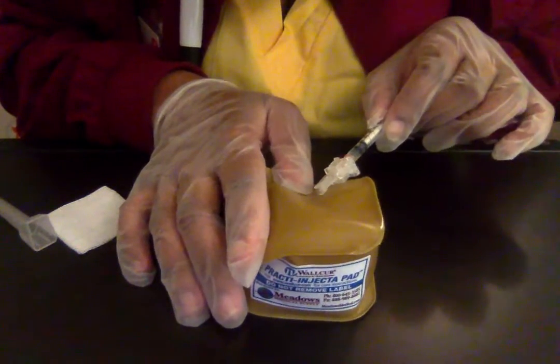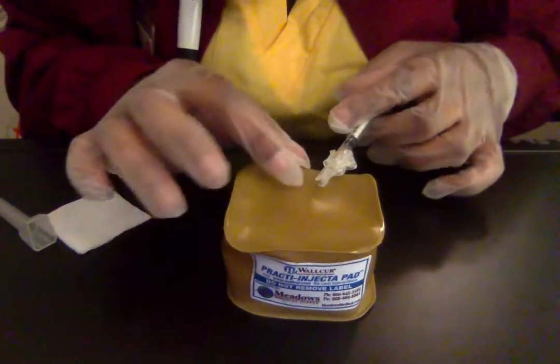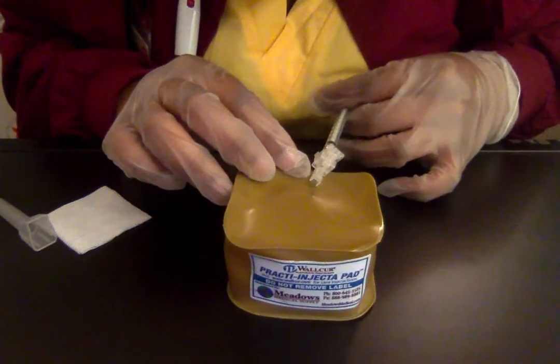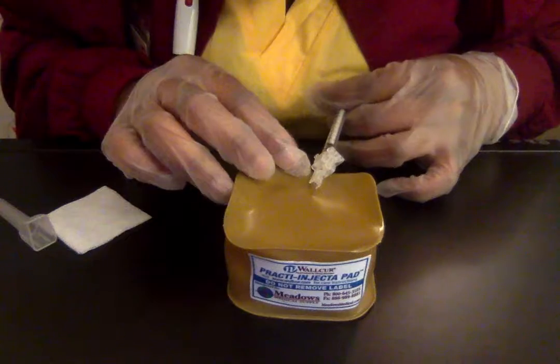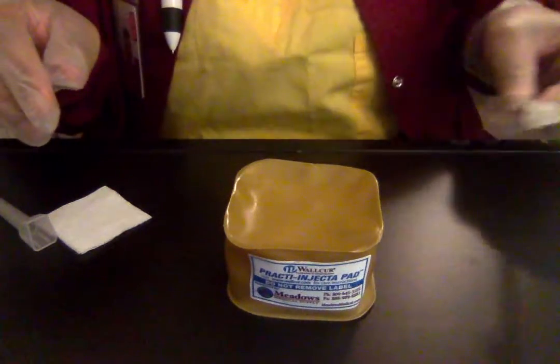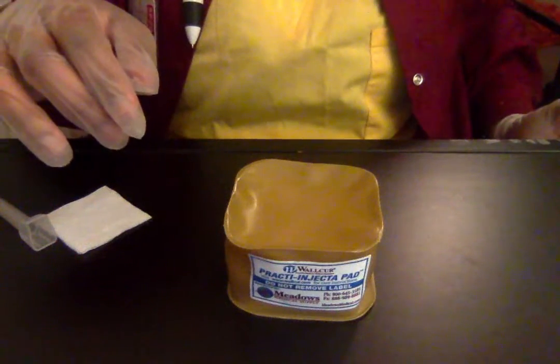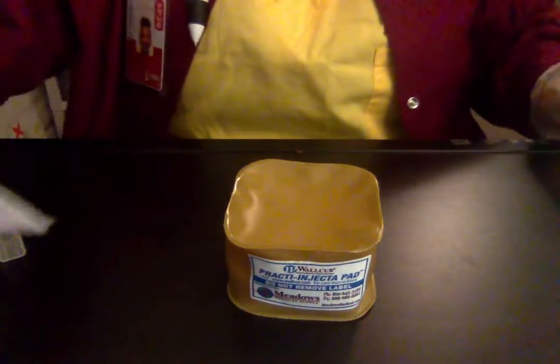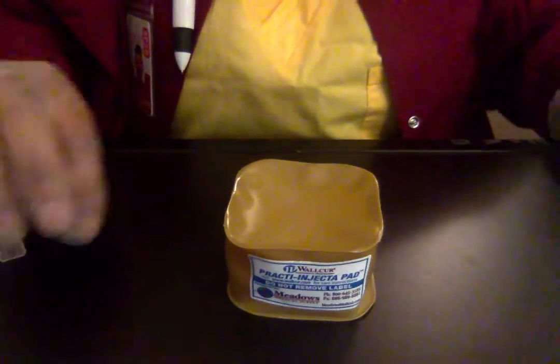dermis. And now I'm under, and I can see my needle a little bit through there. So then I'm going to just go ahead and slowly insert, and it's going to create a little bleb. So then I'm just going to take it out, make sure to activate my safety mechanism. And now I'm just going to take a gauze and just wipe over it lightly because we don't want to mess with the bleb that we have set there.